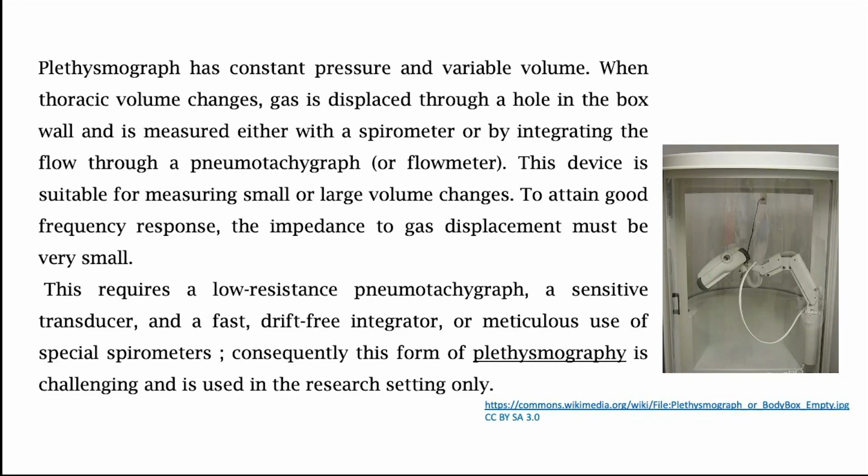But what we must recall is that the person breathes through a tube from outside, not from inside. We only measure the change in the chamber volume or the chest volume by measuring the pressure change.